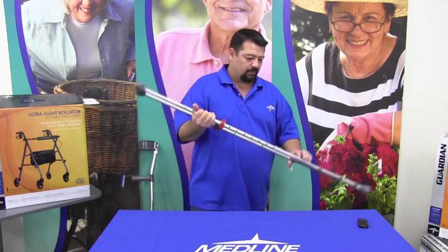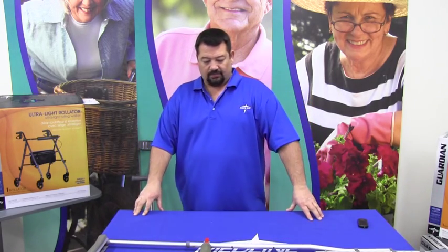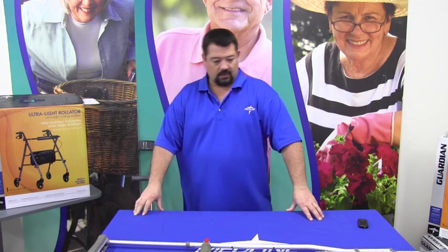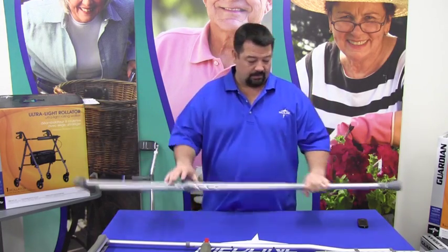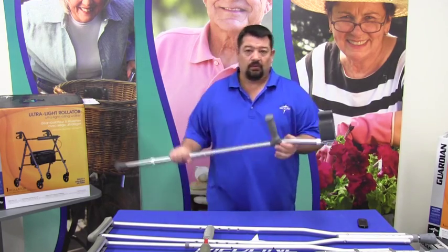So what we've covered is the sizing of the universal crutch, axillary style. We've gone over standard axillary crutches, adjusting with wing nuts and push buttons. And we've gone over forearm crutches.